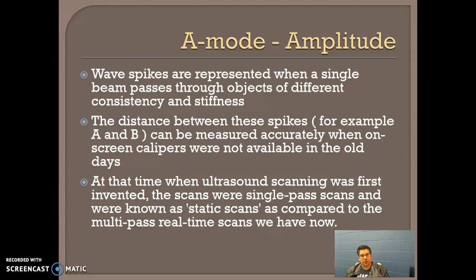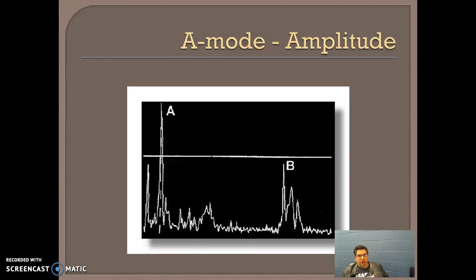So nothing new on this slide here. So here's a great example. You can see at reflector A, between reflector A and reflector B, we have very discrete peaks, which means pretty much for our purposes easily discerned peaks. And so we could very easily tell what the difference in depth is between these two peaks. Again, attenuation has a say in reflector strength, but when we're trying to look at depth, this was useful.